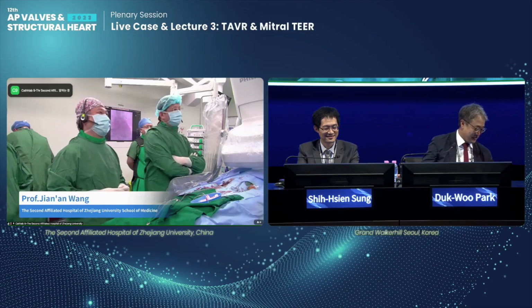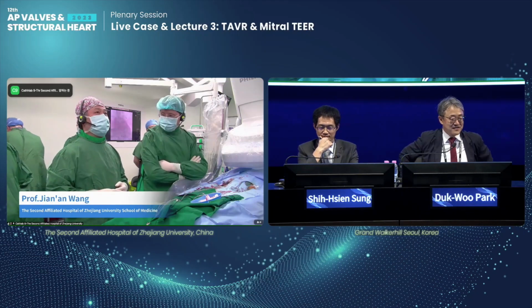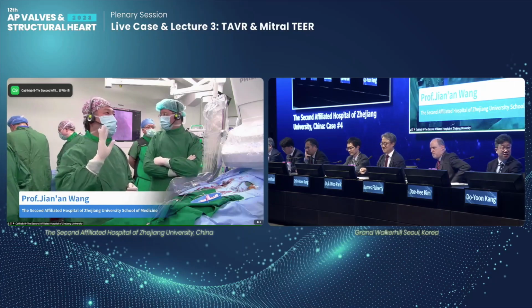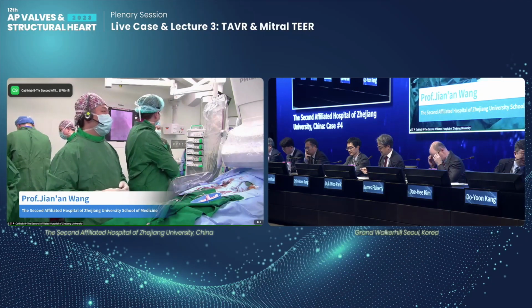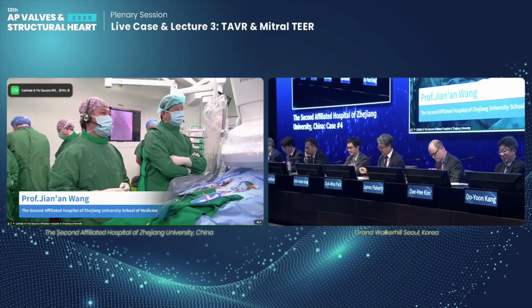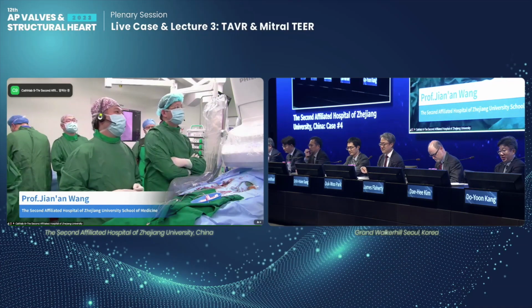Today, work with me. I have several colleagues. As you know, Dr. Liu is next to me, and good afternoon. And several doctors, fellows, and also we have echocardiography and anesthesiologists. So first, I would like to invite Dr. Liu to introduce the case. Dr. Liu, welcome.